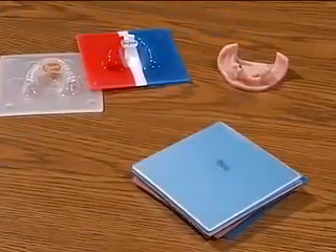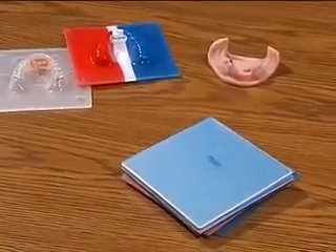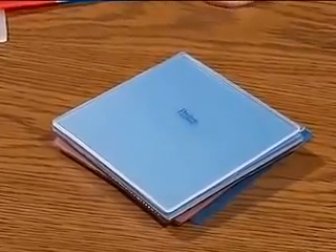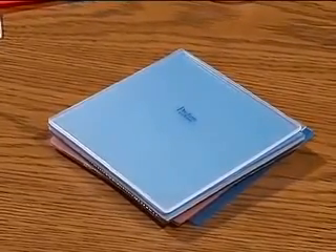Next, we have the ProForm Night Guard material, which is about 30% denser than the mouth guard material, and this aids in prevention against wear when the patient is grinding their teeth.